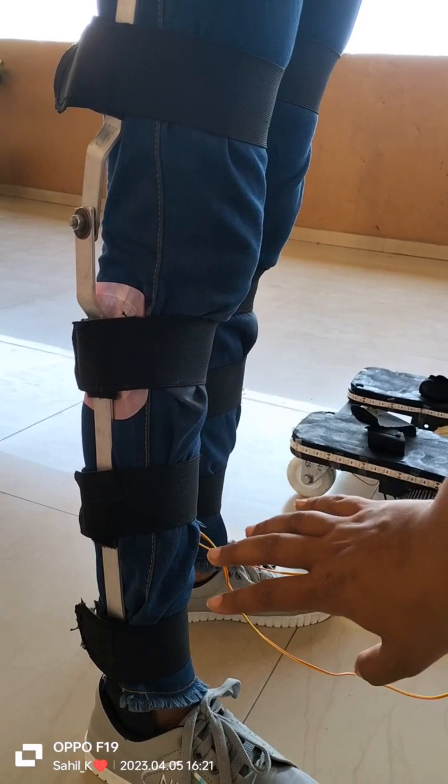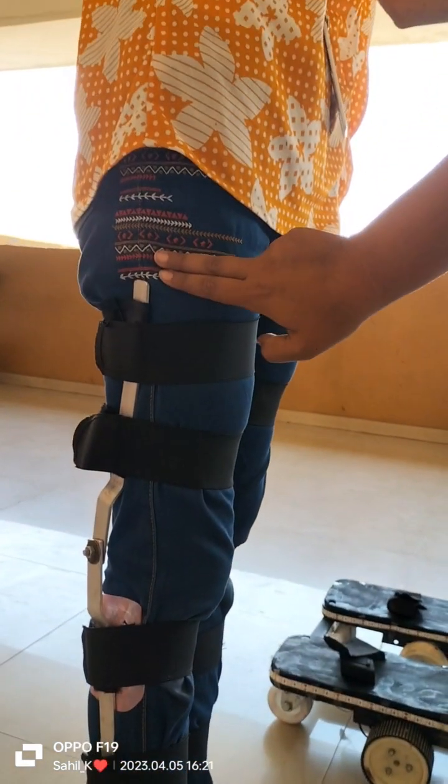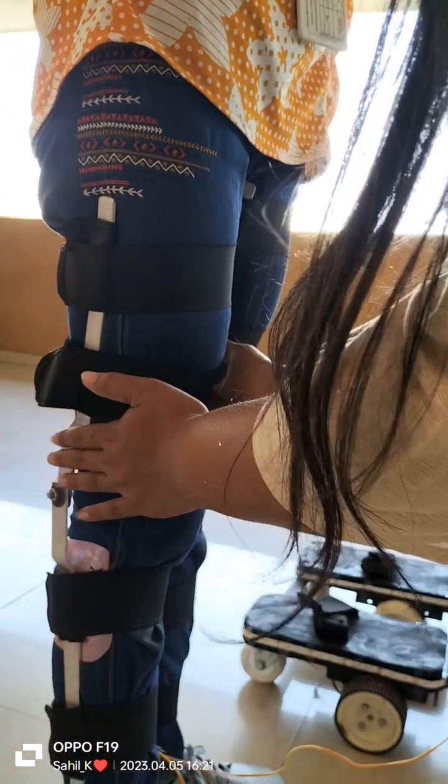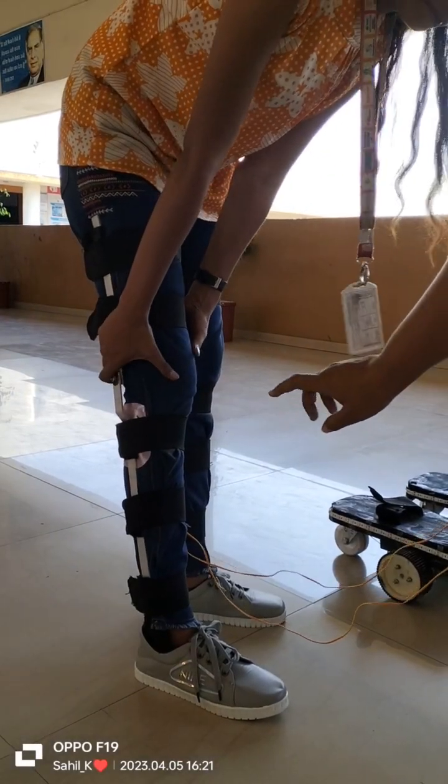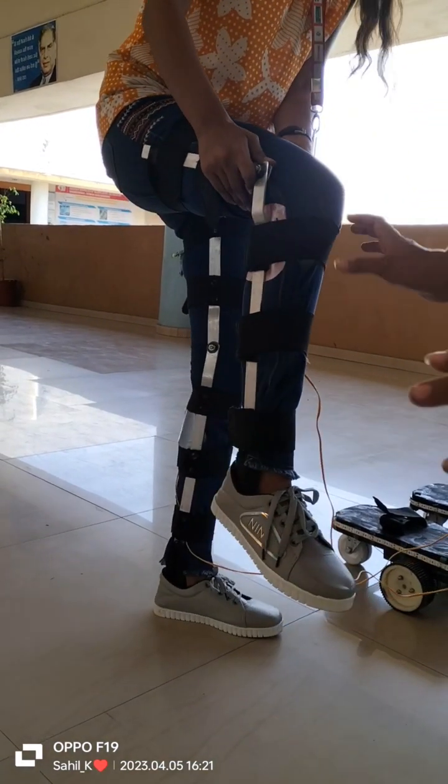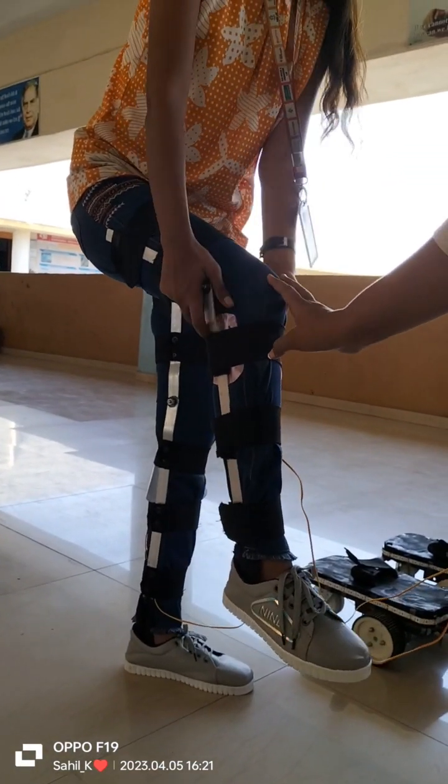This efficient smart braces give support to the ankle, knee, and thigh. It has compatible elasticity which can be fitted for any size, and is flexible enough that a person can sit or walk efficiently with bending in the knee posture.